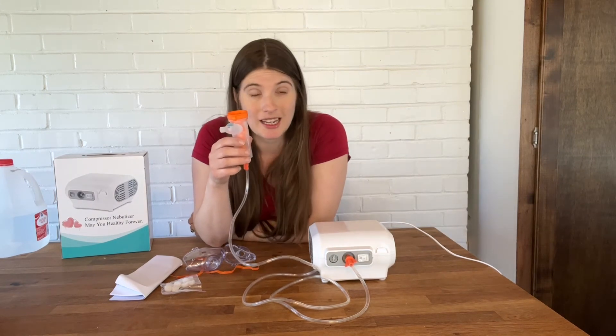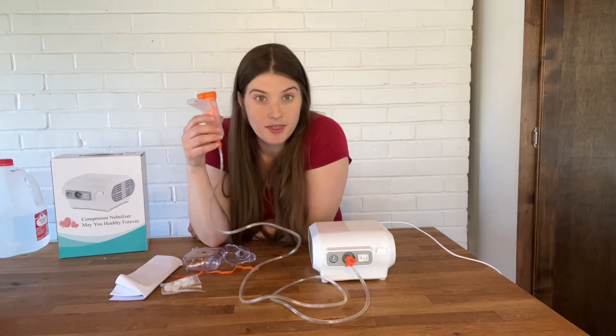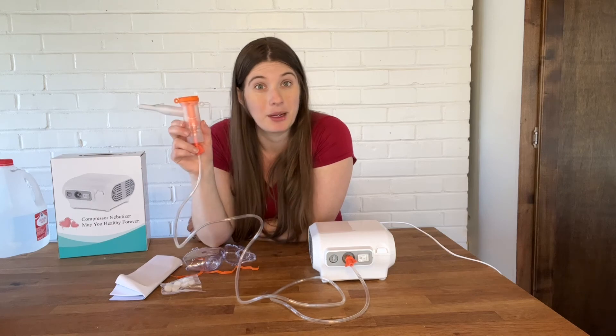This nebulizer has a fast atomization rate up to 12 minutes per treatment. It is stable and long lasting, made of high quality PVC material, with good heat dissipation and a strong power source. This nebulizer will meet all of your home medical needs when it comes to respiratory health. I cannot recommend this product enough.